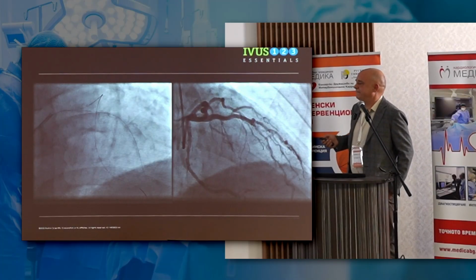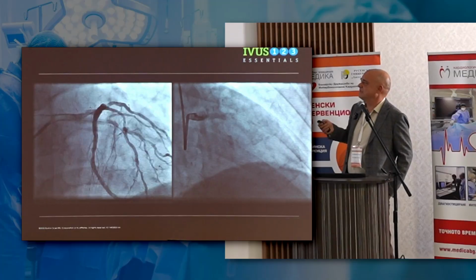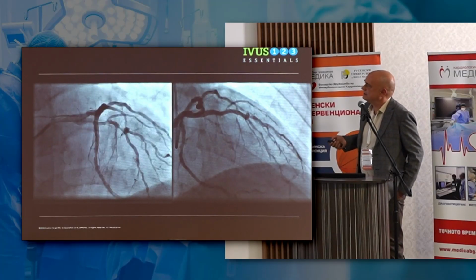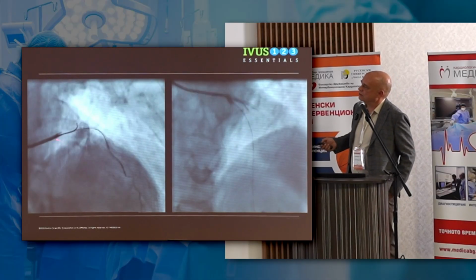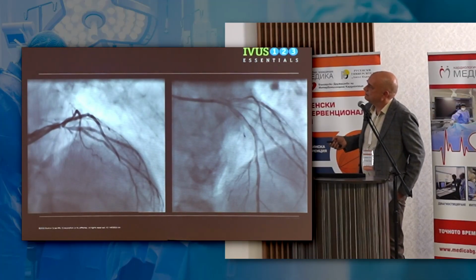We do not have information about rotablation, about using the cutting balloon, or changing strategy after IVUS. And we can go to other patients here. It's a subocclusion of the proximal LAD, a complex lesion with a good final result.